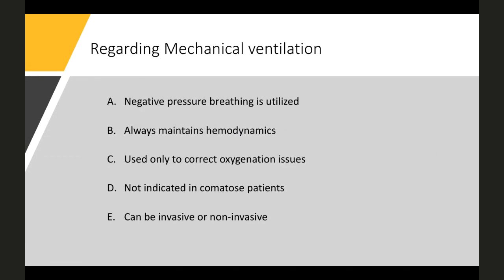And it's not indicated in comatose patients. It's a wrong statement. It is definitely indicated. So we are happy that people are still thinking about non-invasive options also, because when we manage the patient in a real-time scenario, that option we need to consider seriously.